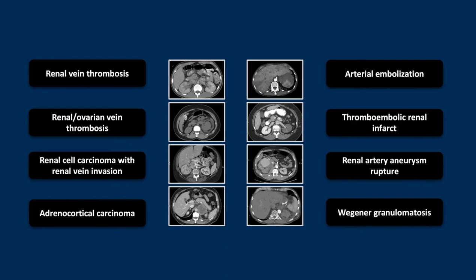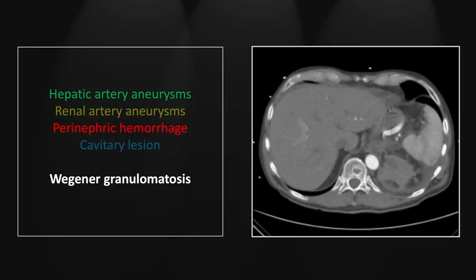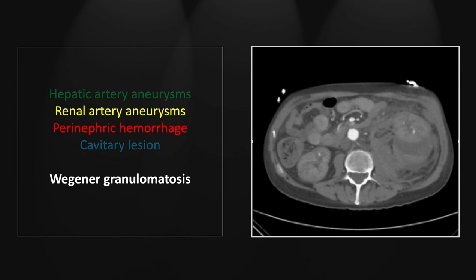Our last case is of Wegener granulomatosis. There are multiple well-circumscribed rounded contrast collections within the liver — this is an arterial phase scan, and those are consistent with hepatic artery aneurysms. Note also this irregular, slightly hyperdense fluid collection in the suprarenal region, representing perinephric hemorrhage. Note in the kidneys as well, we have these rounded contrast collections consistent with renal artery aneurysms, and a very large posterior left perinephric fluid collection with layering density consistent with hemorrhage.